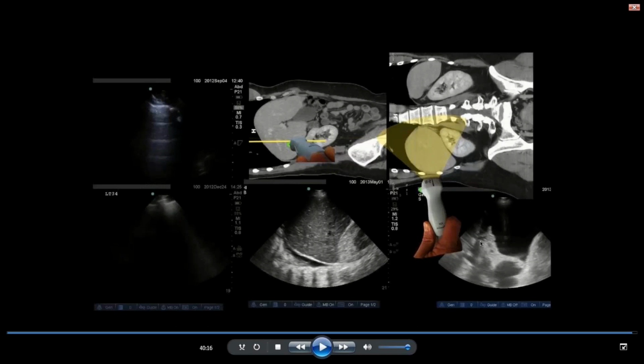And I'll touch on some of the literature out there, and Dr. Bhagra will tie this in again to practical clinical reality, although she knows the research better than I do. But it just gives me a chance to say something. So if you follow the BLUE protocol, the A pattern almost seems to steer you towards exclusion of other causes of shortness of breath.